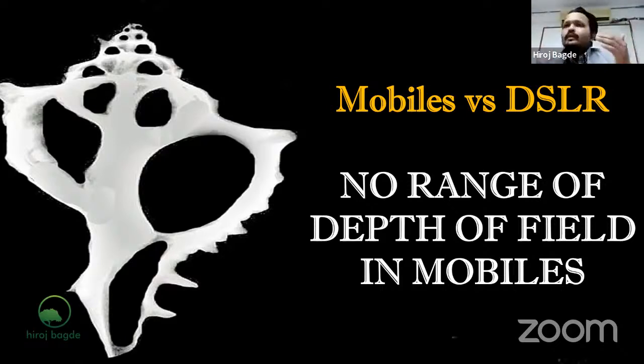Everything depends on the type of lens aperture that has been opened. So I need to check whether mobiles offer the f number as a variable. There are very few mobiles that do, and they have an f number of f2.8 to 3.4 at most. We don't have f11 or f22 like that, so we have to stick with DSLRs. I am not against anyone doing mobile photography. I do it myself, but I am telling you the advantages of having a DSLR.